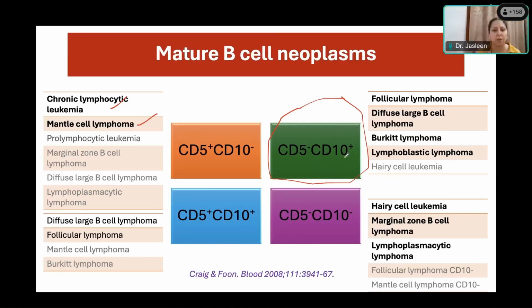Follicular lymphoma, right? Absolutely. So we are now slowly looking at first morphology of the peripheral blood, and then the bone marrow aspirate, and then the bone marrow biopsy, then doing an IHC, and finally doing a flow cytometry. We have reached the diagnosis of a follicular lymphoma that is there in the bone marrow infiltration.